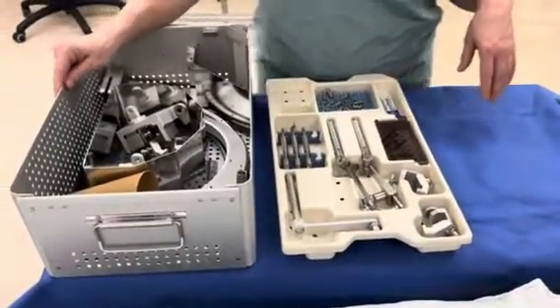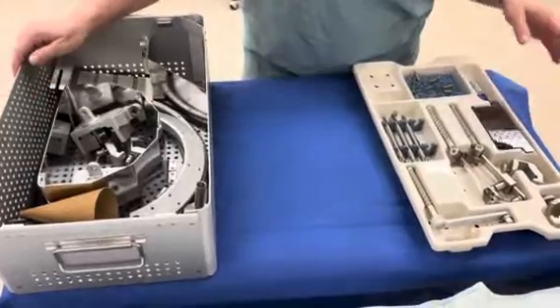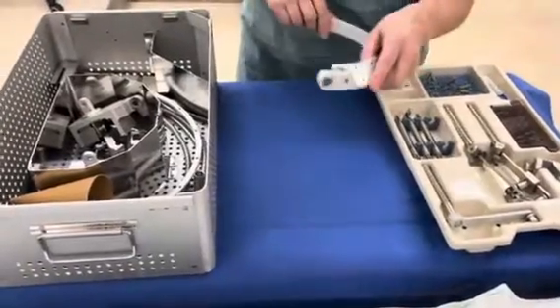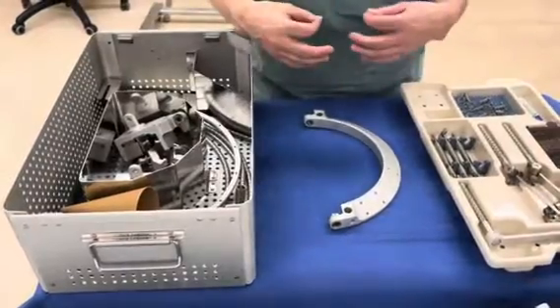This is the Sugita head frame. I'm going to show you how to put it together to have it ready for the surgeon to use. They're going to use this when they want to attach it onto the Sugita frame so that they can rest their hands on it and not move.